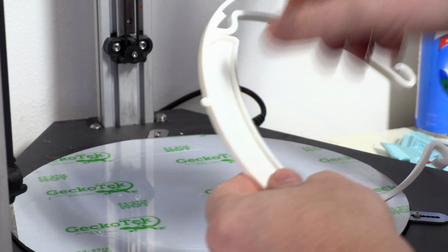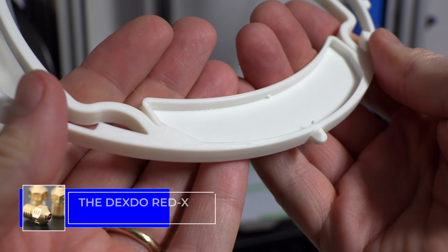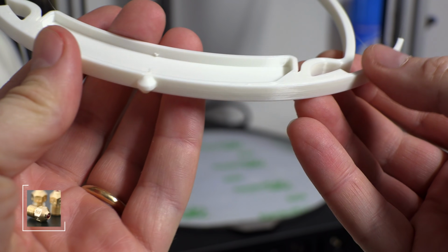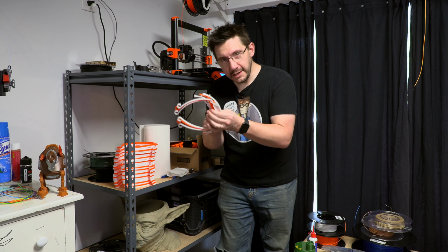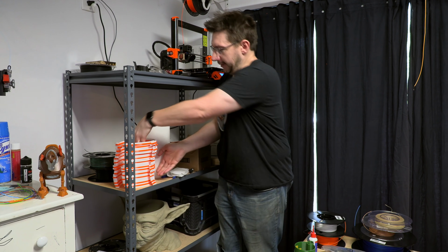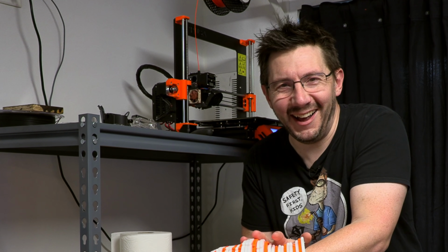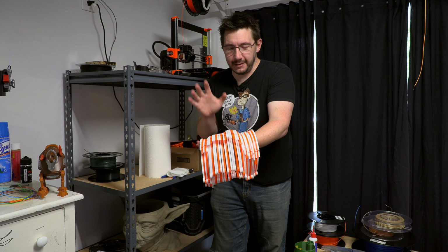I love a flexible build plate. So that's running a DexDo 0.6 millimeter ruby nozzle. I think it did a fantastic job. Look at that. Yeah, that's nice and smooth. We've got these three, which means we just need to add them to this giant pile right here. Oh my goodness. Let's get these down to the garage and check the other machines, and let's go have a look.